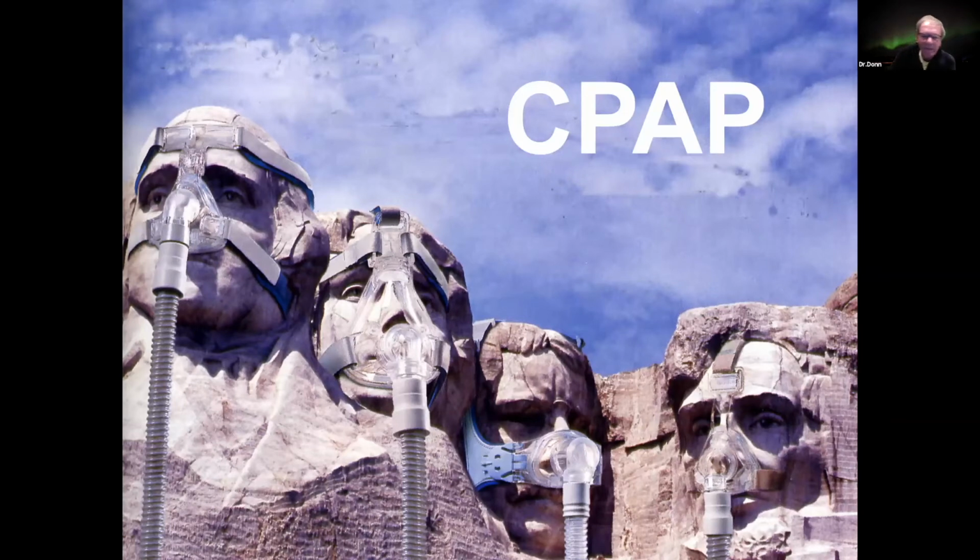So we moved to trying to find alternative methods for treating these. And you know, this is probably the most famous pendulum in neonatal intensive care. In the early 1970s, a good neonatologist did everything that he possibly could to try to keep the baby off a mechanical ventilator, which at that time was considered to be almost the sine qua non for you're going to die. And so CPAP arose as a potential alternative for the treatment of babies with respiratory distress syndrome.